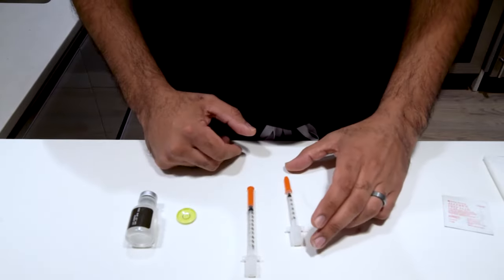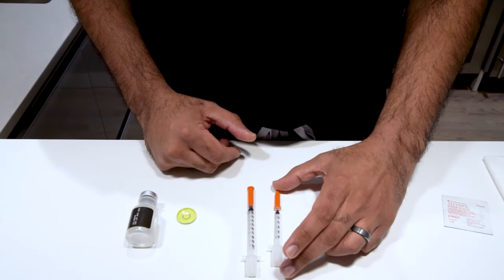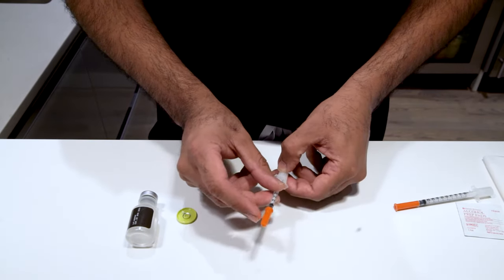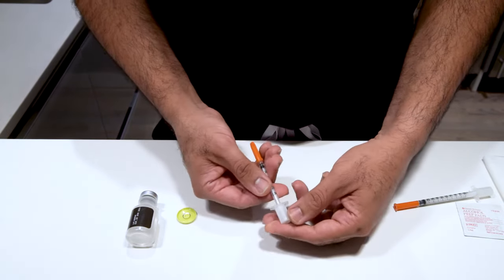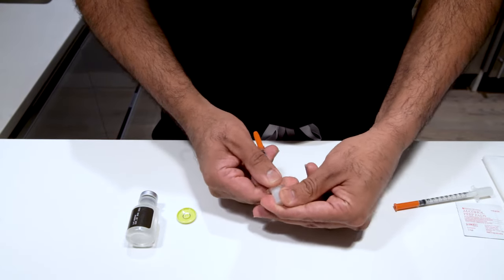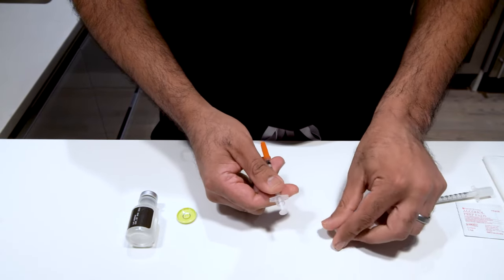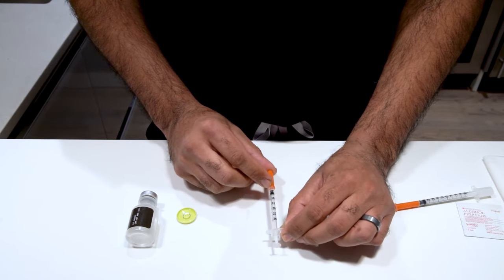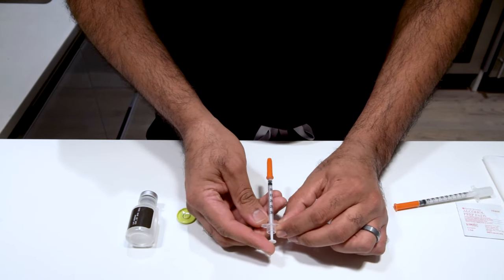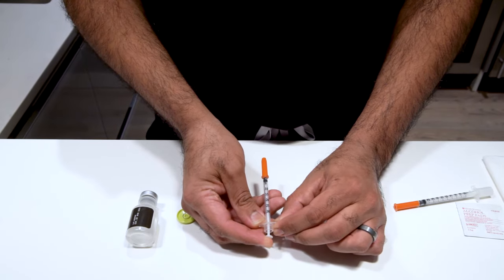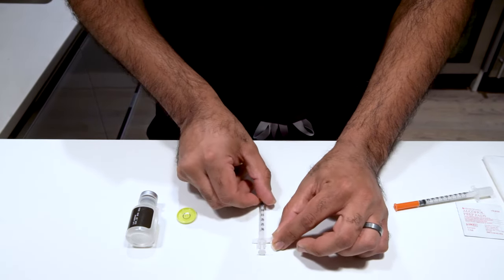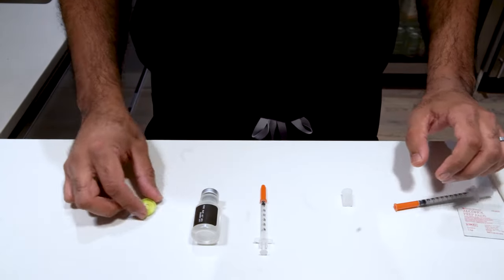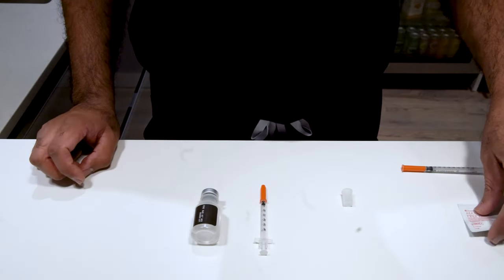Every syringe has a cap on the top protecting the needle, and sometimes it has a cap actually protecting the plunger. Simply twist the cap off the plunger if it exists. Take a look at the plunger and make sure that it's all the way up to the zero mark. If it's not, go ahead and push that plunger all the way to the top before getting started. We're going to be using our 30 unit syringe today with our medication to do our injections.